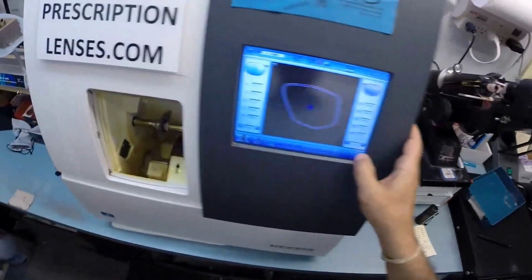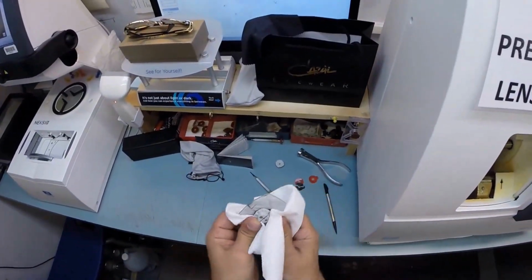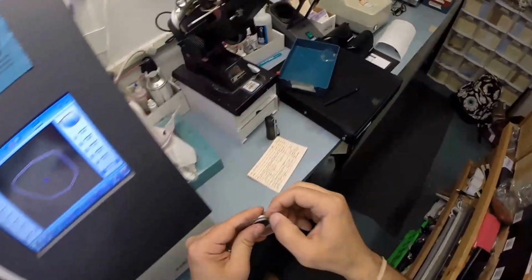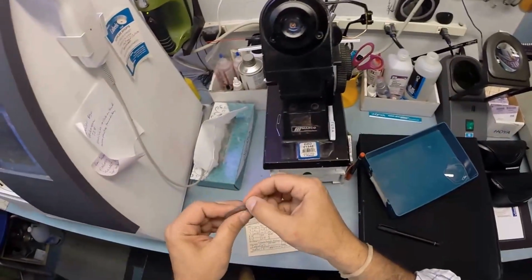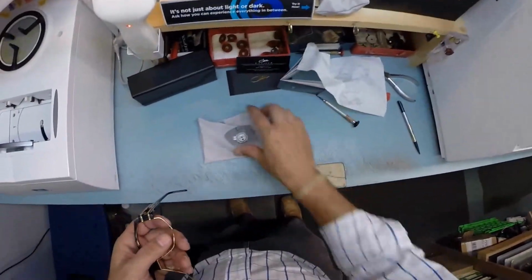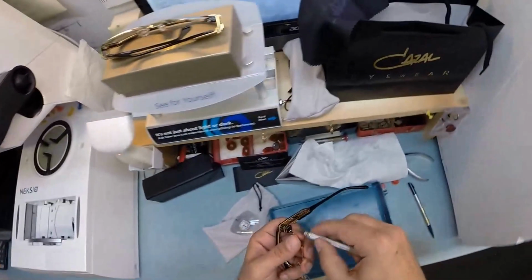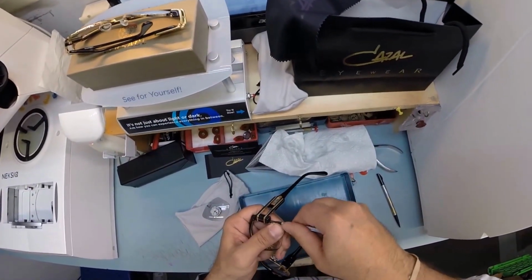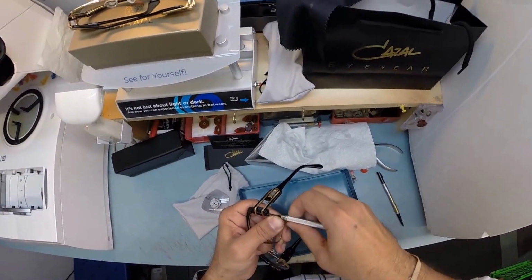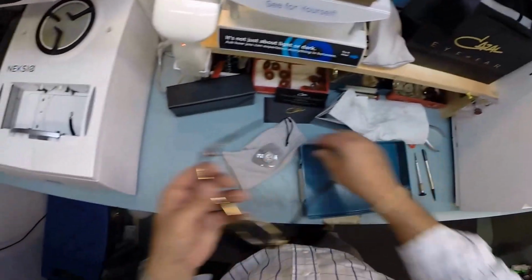All right, so your left lens is done. Let's go ahead and pull that out. Dry everything off there. Make sure there's no optical debris on the lens. Come back down here. Put your lens on your cleaning cloth bag. How about that? Ooh, let me grab this tray. I do not want this screw to jump out at me while I'm working on it. I am too old to get on my hands and knees and look for this gold screw. So that's why I'm going to keep it upside down so it cannot jump out.